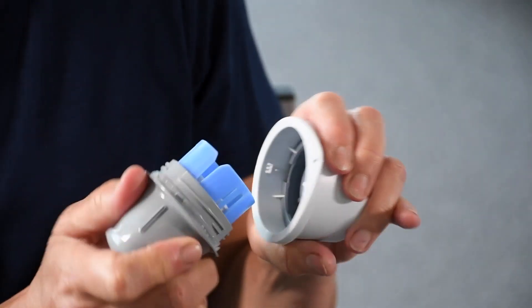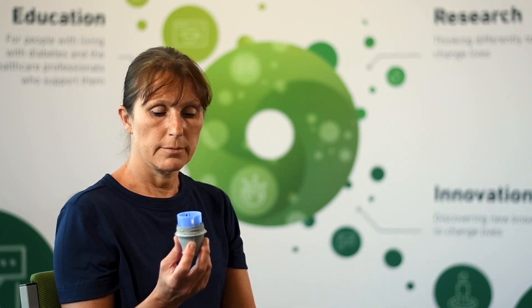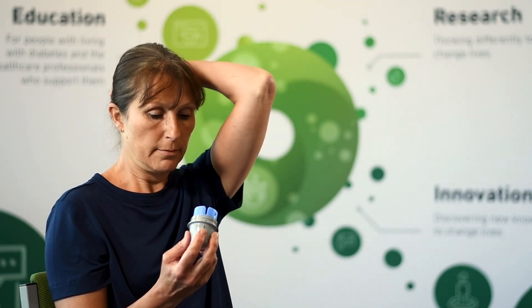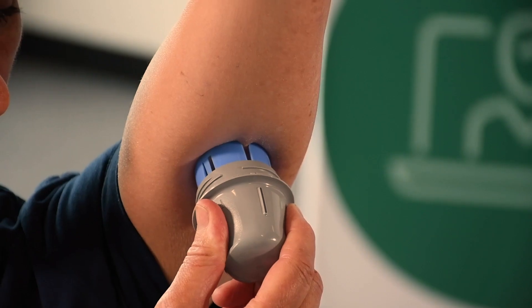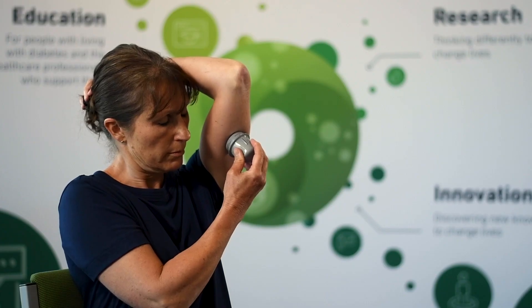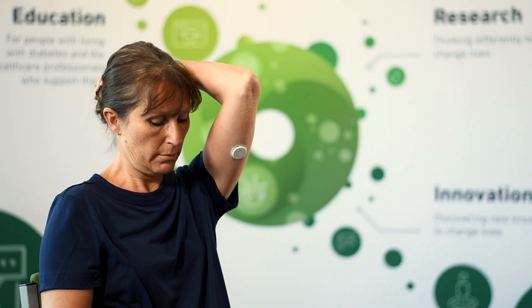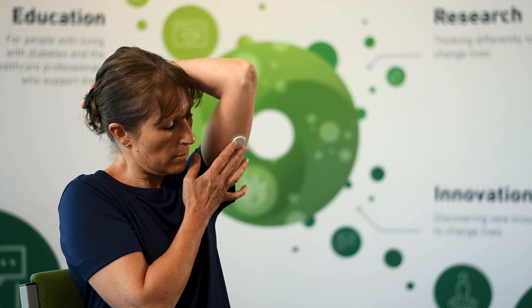Now lift up the grey part of the applicator. The sensor is now sitting inside the applicator. You will notice there is a needle which will enable the sensor to be put into your arm — the needle obviously won't stay in place. Once the area on your arm is dry, raise your arm, apply the blue part to your arm, keep it in place, and push straight towards your arm. Once you hear the click, pull the applicator away — the sensor is now inserted. Gently push the sensor around the adhesive to make sure it is firmly in place.